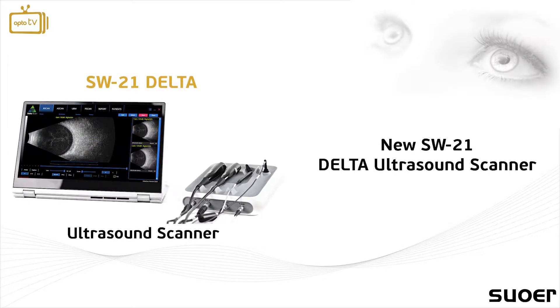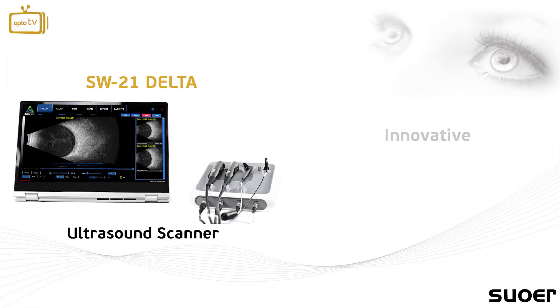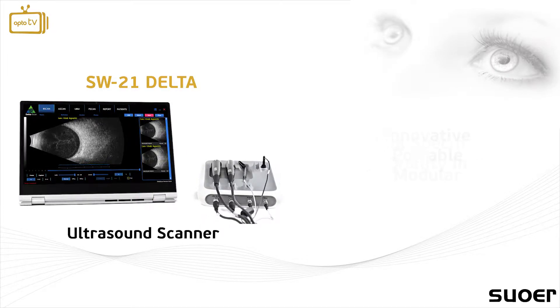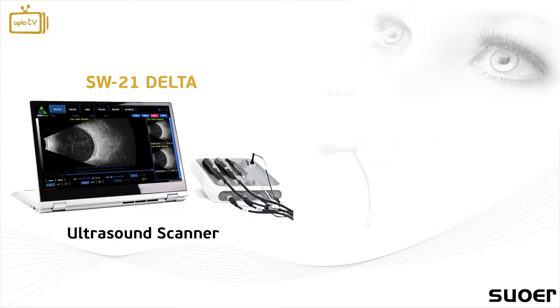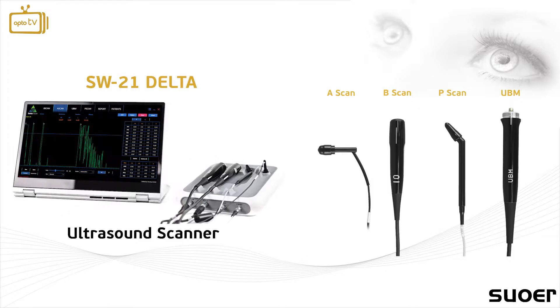The all-new SW21 Delta Ultrasound Scanner by SUOWARE is an innovative, portable and modular ultrasound instrument with premium specifications and second-to-none quality images. The SW21 supports A-scan, B-scan, pachymetry and UBM scanning probes.